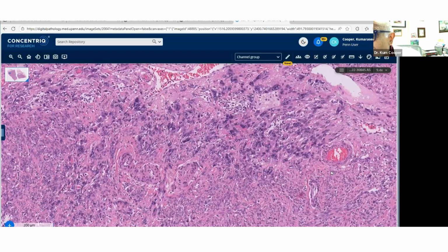Now, just to address more of your questions, I really love your questions. I suppose the focus of necrosis without granulation, what would you call this? So focus of necrosis without granulation means there's an abrupt change between tumor cells. In this case, we're talking about leiomyosarcoma, so smooth muscle cells, an abrupt change and then necrosis. And that necrosis has to show detritus, nuclear debris as well.